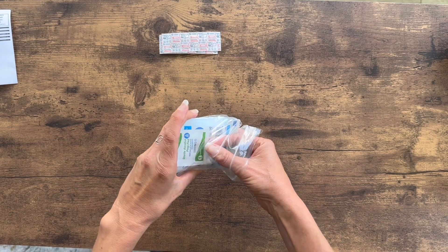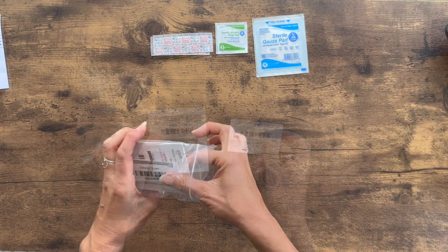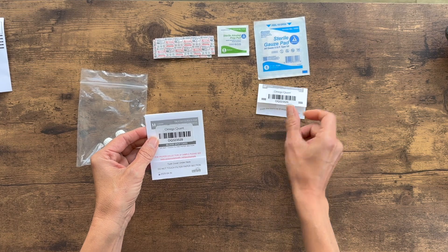This includes your band-aid, your alcohol wipe, your gauze, and whichever test cards came with your kit.